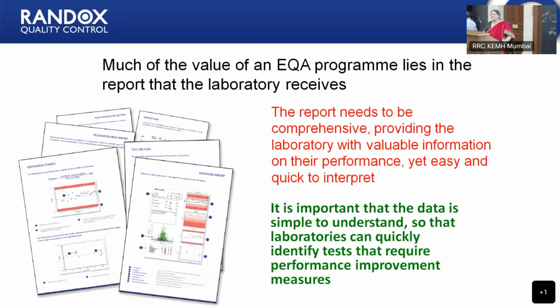When I say any laboratory with a full quality management system, it will have two independent but complementary systems in place, named IQC and EQA. Now, what is EQA? EQA is External Quality Assessment Program. How does it operate? A blind sample is sent to all the laboratories participating in the EQA program.